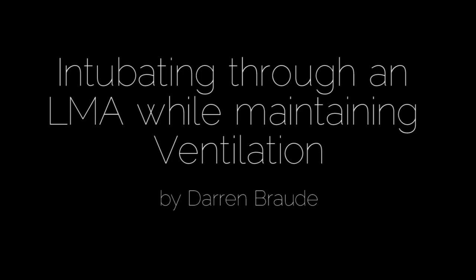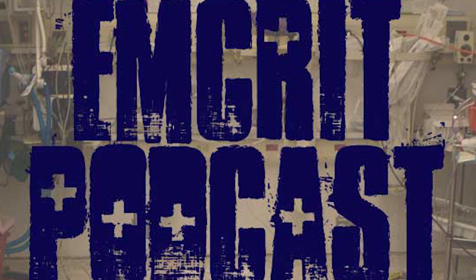Hey folks, Weingart here, and this is an EMCrit video. A lot of folks have asked me to explain how I intubate through intubating laryngeal mask airways. The method I use was taught to me by Dan Cook, inventor of the AirQ.